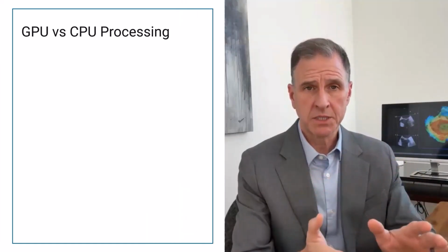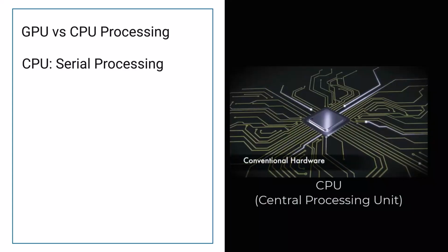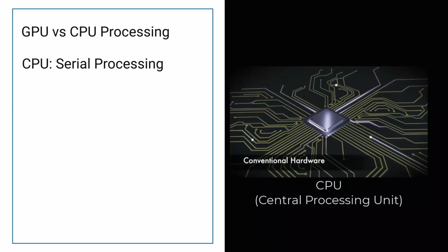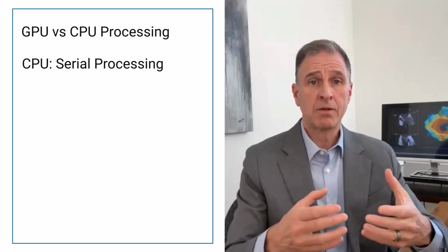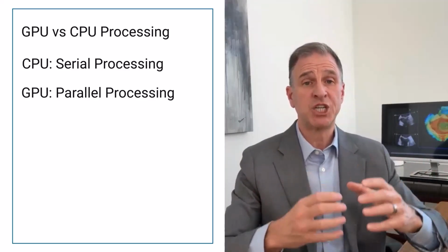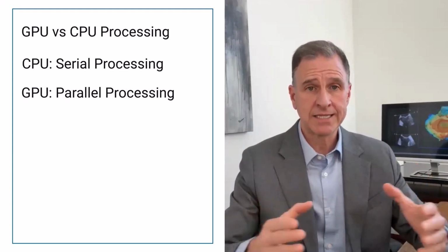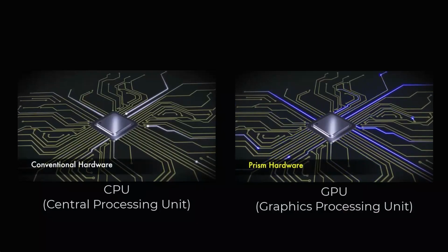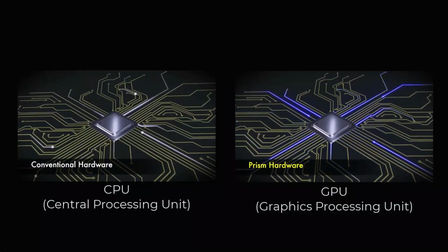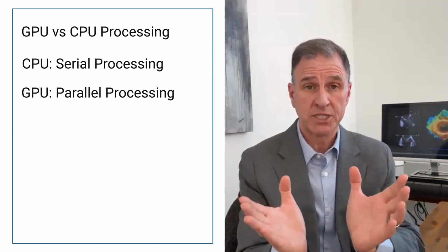Most ultrasound-based systems operate under a CPU, a central processing unit, in which the data calculations are done in series, one after another. Now, there is a new way of processing ultrasound data, and it's done through a GPU, a graphics processing unit, that processes the entire data set, and all of that is done in parallel. So you have anywhere between 1,000 and 100,000 times more processing power to be able to measure the velocities of all the data that are presented to you.